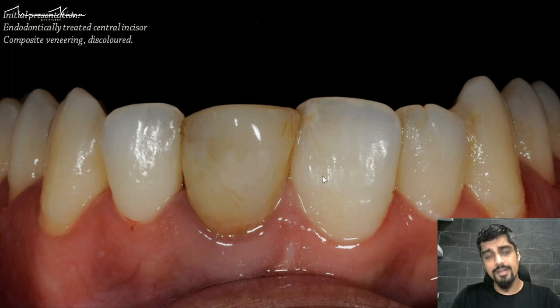We'll be able to get symmetry not only in color, but also in shape, size, and texture. What we've done here is just one central, which is a bigger challenge. Let's go and see how we've done it.